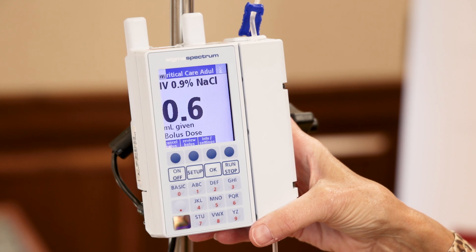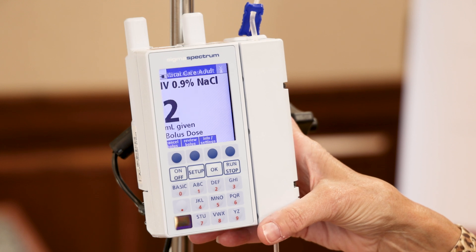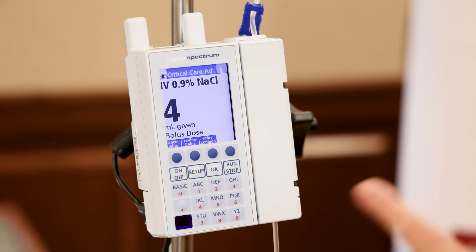Our bolus is now infusing and it will count up to the mLs I typed in. On the upper left corner of the screen is an icon indicating that the battery is being charged — it's plugged in. You see the little plug, and it toggles to show how much battery life is remaining.